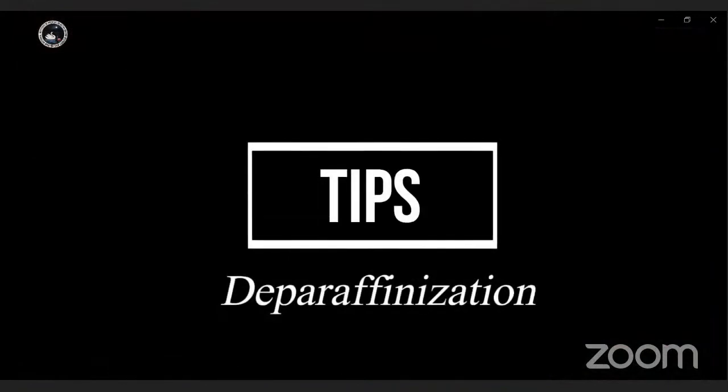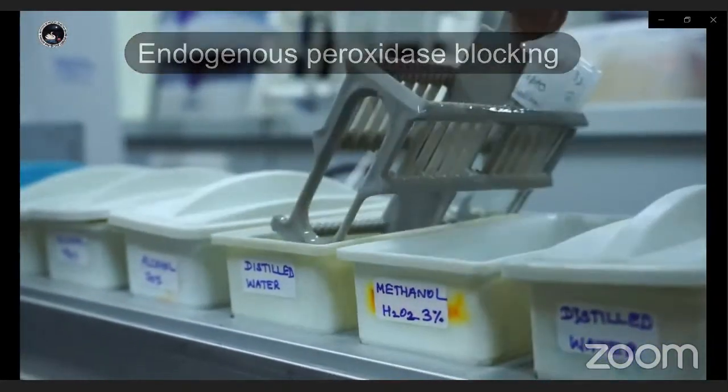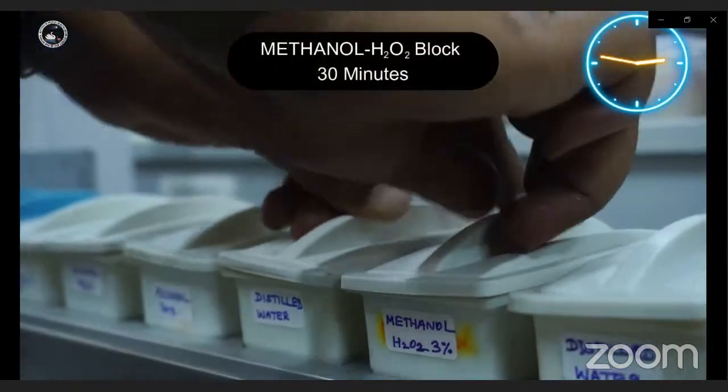Deparaffinization is the most critical step. If this step is not performed properly, staining quality will not work. Next important step is endogenous peroxidase blocking in freshly prepared 3% H2O2 in methanol for 20 to 30 minutes.